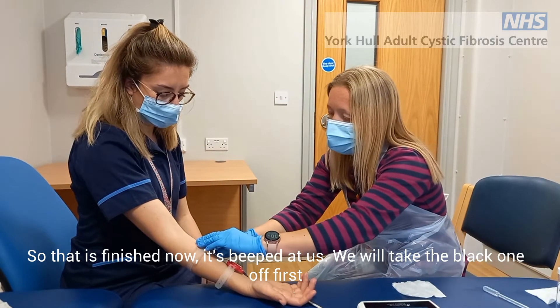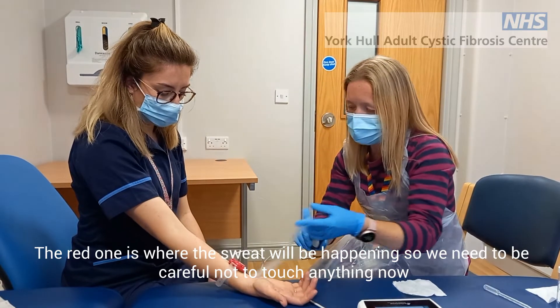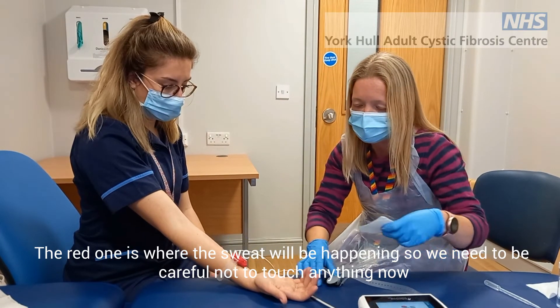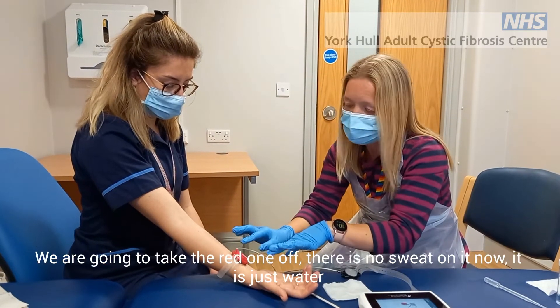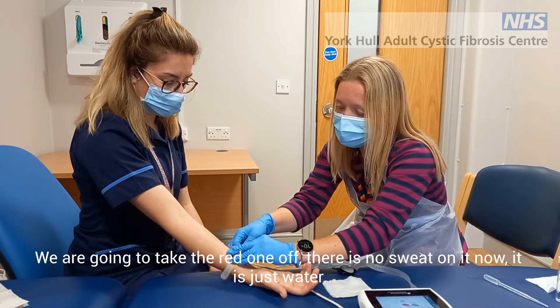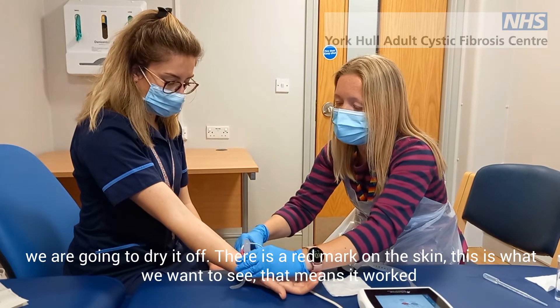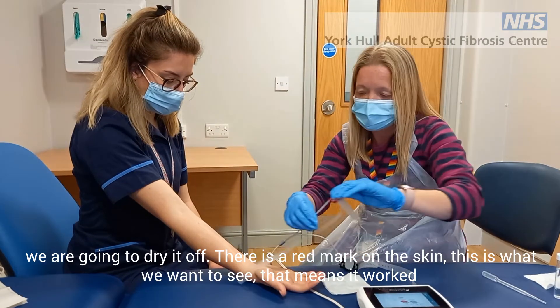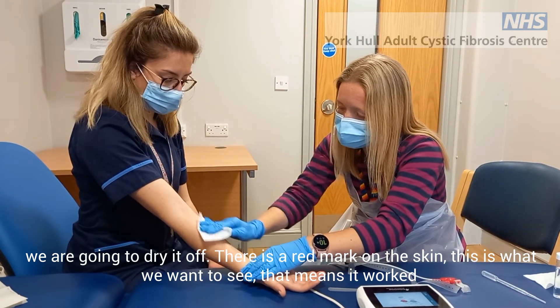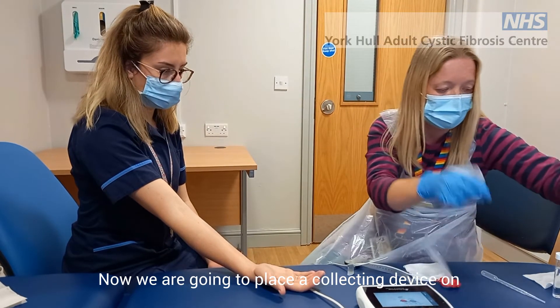So we'll take the black one off first. The red one is where the sweating will be happening, so we need to make sure not to touch it. We're going to take the red one off and give it a clean. This is just the water we put on there — we're going to dry that off. There are red marks on the skin, and that's what we want to see because it means it's worked.